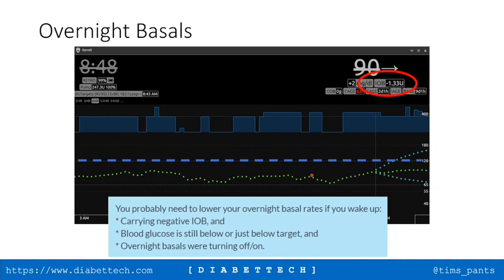The line is pretty flat, so not so sure it's basal or ISF. Could be, but I would also look at the duration of insulin, because normally if basals are not correct, you have more changing in the insulin lines. I saw on my examples.